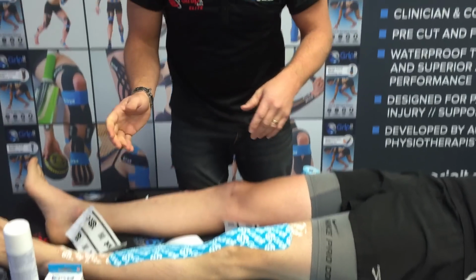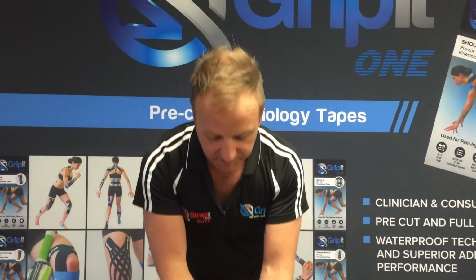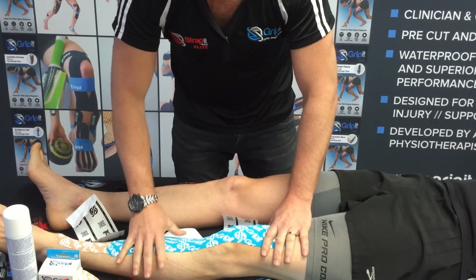Okay, so guys, that's pretty much the technique for the knee. Thanks for listening. Give it a go. Remember to apply that tension with the knee in the shortened position, and I'm sure you'll go a long way with improving your patients' outcomes.